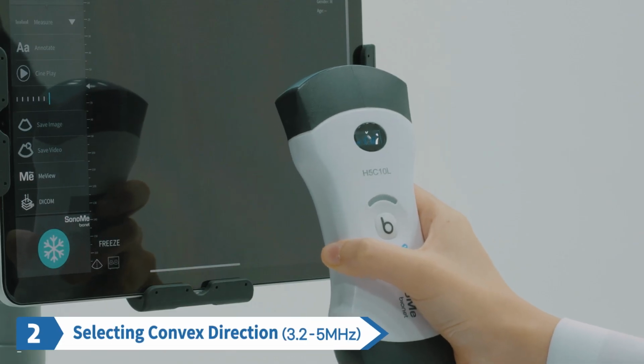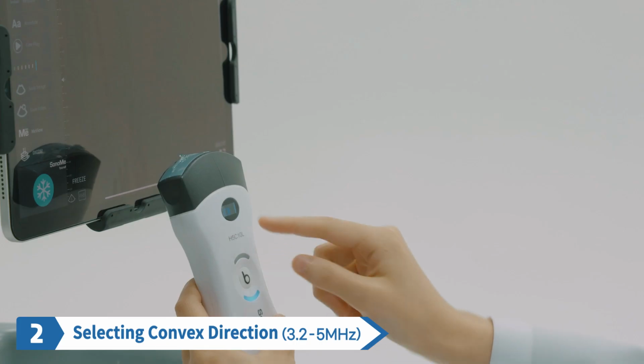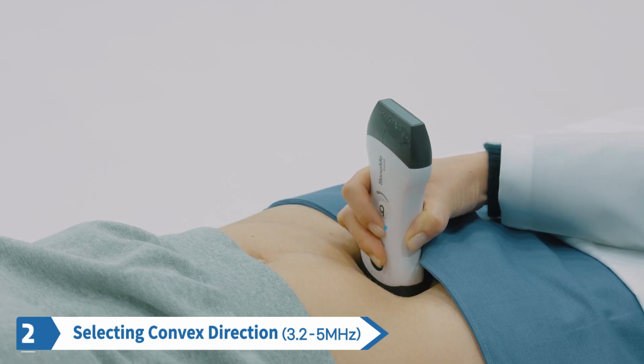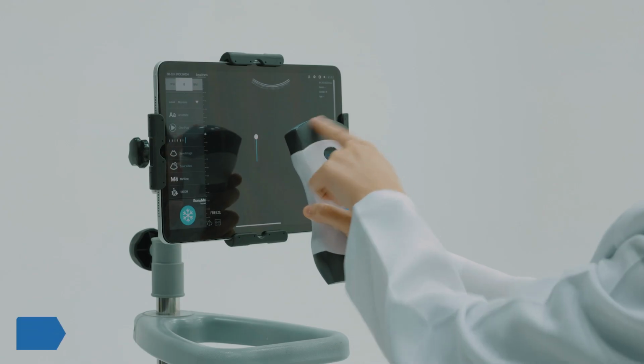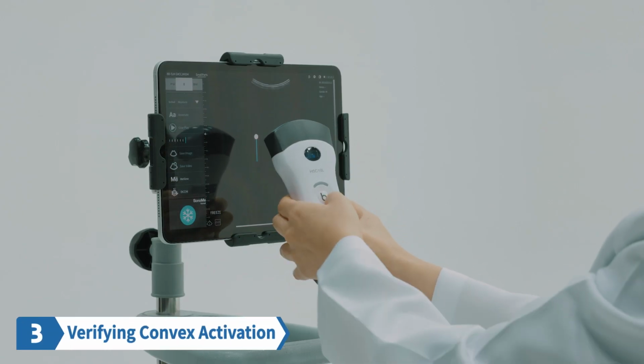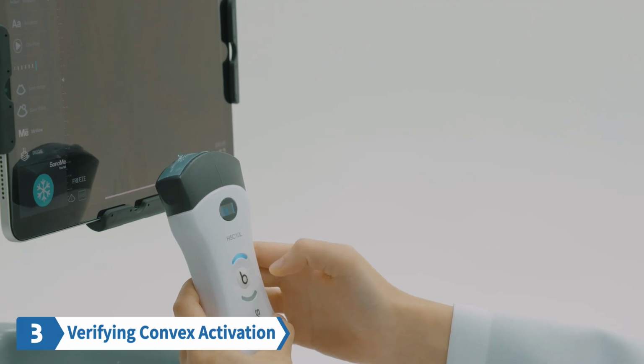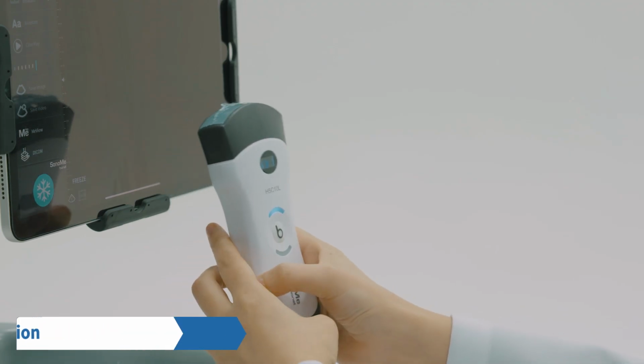2. Convex-type transducers with a low frequency range and a curved surface are ideal for examining the interior of the abdomen or pelvis. 3. Ensure the convex side is activated by checking that the light is on that side. You can activate the other side by pressing and holding the power button.